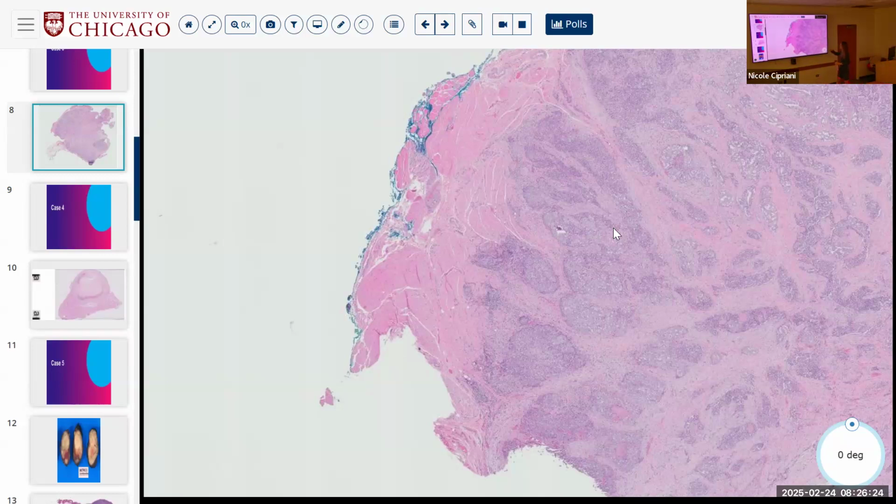Because normally in thyroid, they do not take any strap muscle. So already, if you see grossly, sometimes strap muscle can mimic colloid because it's all brown and it can be hard to tell. But as we gross thyroids, maybe you can practice seeing muscle. If you see skeletal muscle, always sample it because it generally shouldn't be there. And if they have taken this amount of skeletal muscle, that often means they think there's something invading it, right? So that's already a soft sign of there being extrathyroidal extension.